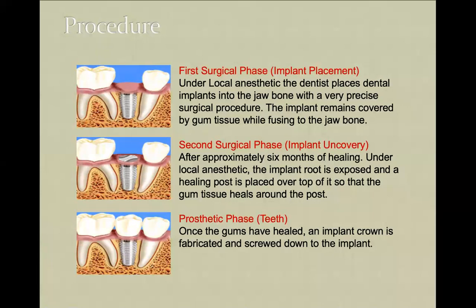What about the timing? Okay, once the implant is placed inside the bone, I'm talking about the conventional and traditional approach. I'm not talking about immediate loading. I'm not talking about SLA active implants. I'm not talking about some kind of specific dental implant.